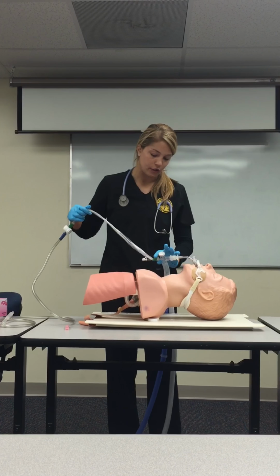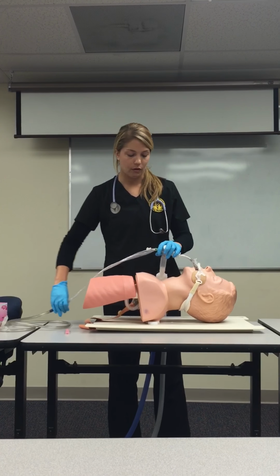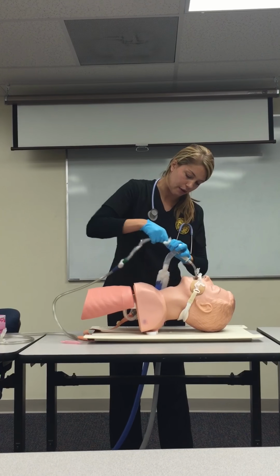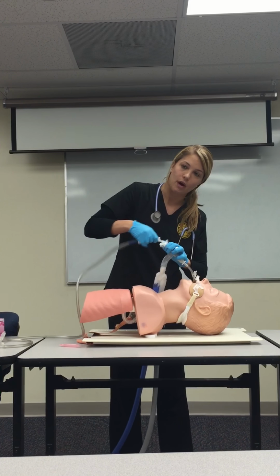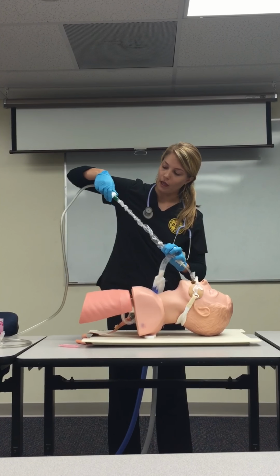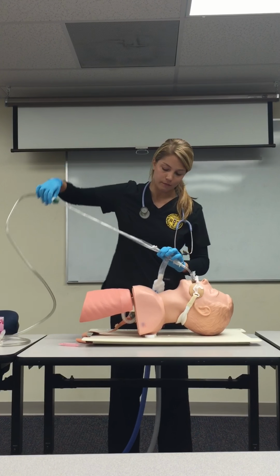Mr. Doe, I'm going to suction you. You're going to have to cough. So I'm going to go ahead and go down with the suction catheter, making sure not to stay down longer than 15 seconds, and I'm monitoring his vitals at the same time. Once I meet resistance, I'm going to pull back and then pull out with intermittent suction.